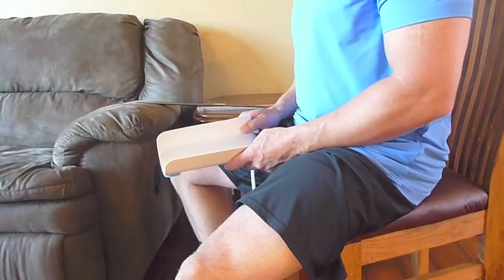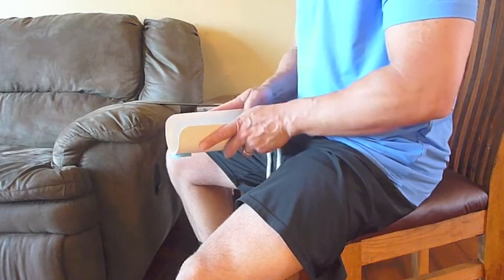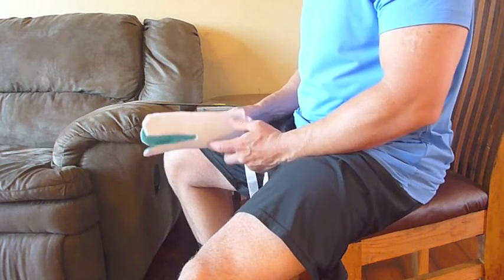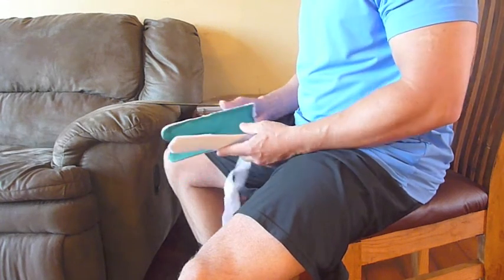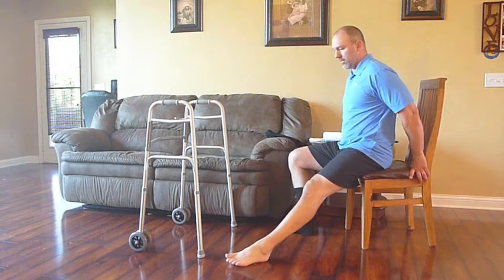Putting on socks using a sock aid. There are two typical types of sock aids: a firm, hard plastic one such as this, and a soft, flexible one such as this. They both have straps that you can hold on to toss it towards your foot. Scoot forward in the chair, keeping the leg in a good position.